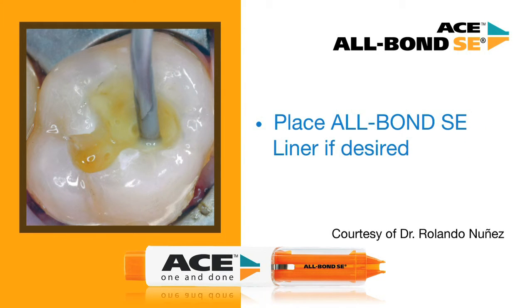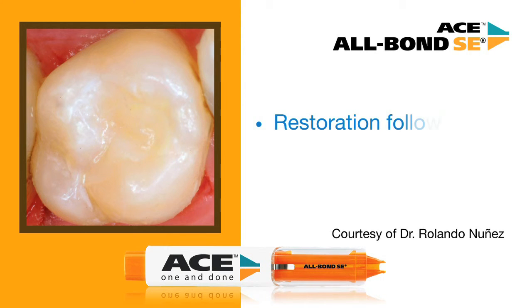It is optional to use Allbond SE liner for the added benefits of radiopacity and long-term stability of the bond. If continuing with placement of the liner, apply a very thin layer and light cure for 10 seconds. Then place composite and finish the restoration.